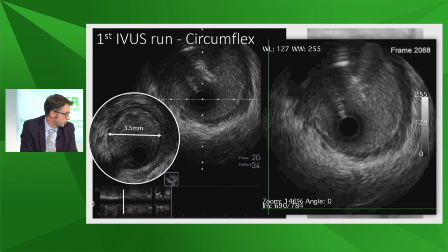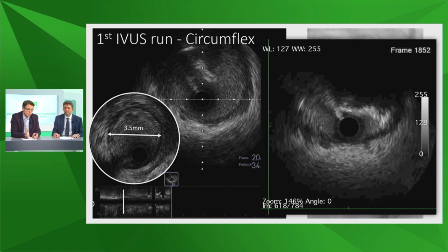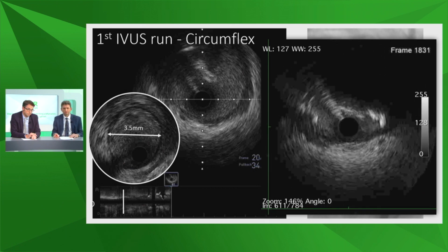I have to say we don't see much thrombus, but I've been ballooning, and I'm sure there was thrombus in view of the acute nature. But certainly this informs us that we've got very high-grade disease. Yeah, and next image will show us again angio after IVUS.